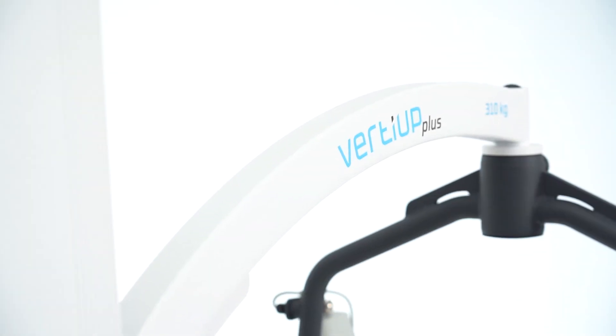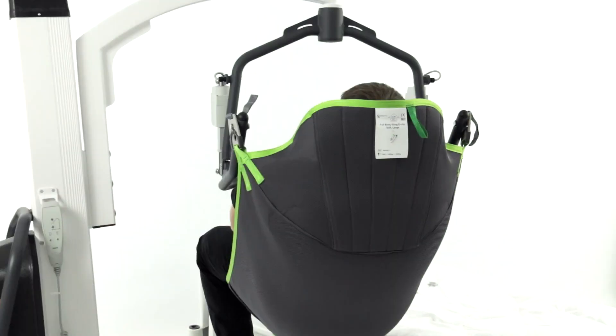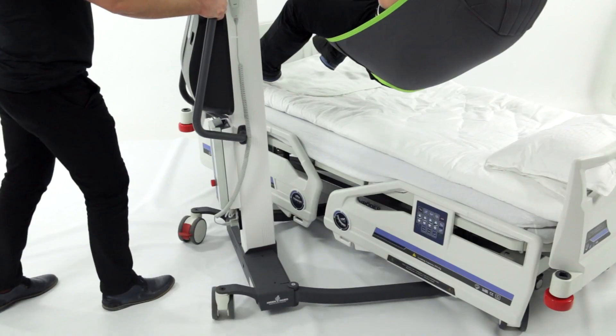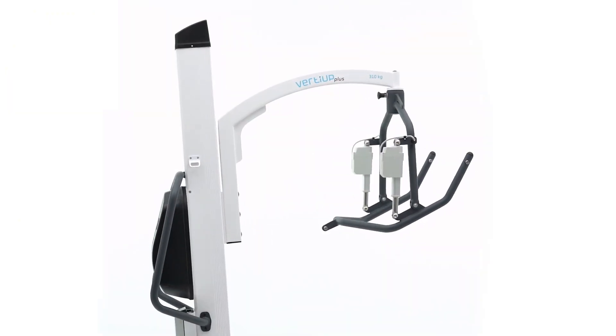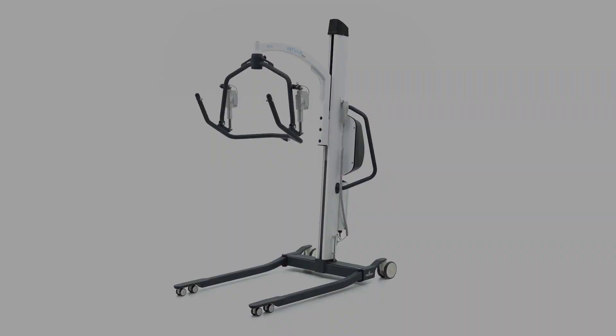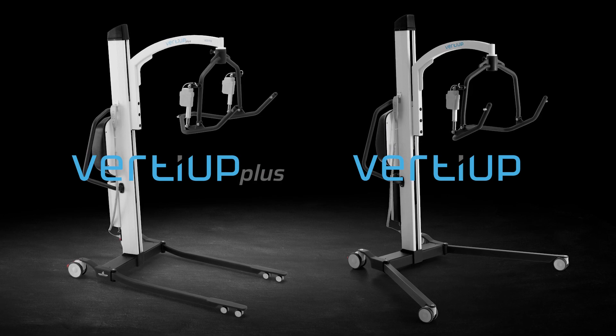VertiUP lift significantly increases the quality of a mobilized person's life and makes the work of care staff much easier. Irreplaceable in hospitals, sanatoriums, nursing homes, rehabilitation centers, and home care.